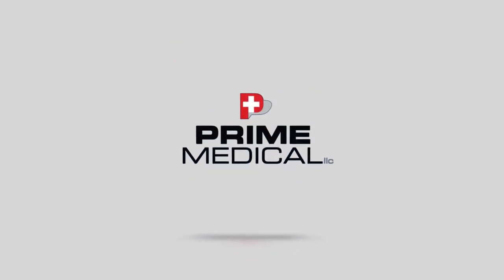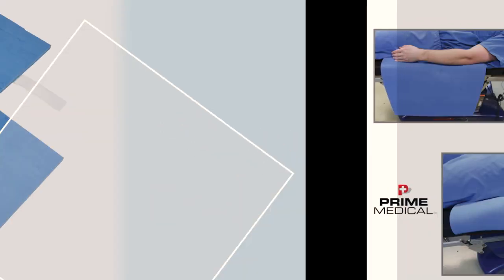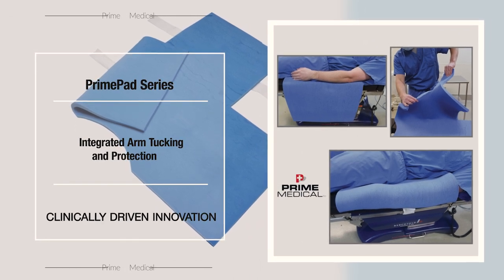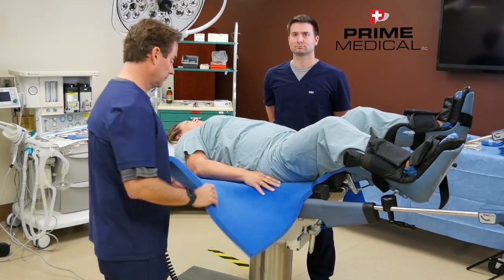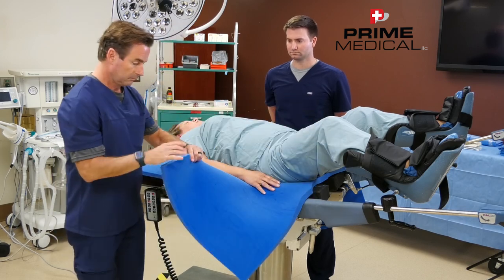Prime Medical. Prime pads are available with integrated arm tucking and protection in our Wing and Wing 2 pad formats. The Prime pad wing material can be customized to the patient by simply holding the material up to the patient's anatomy and tearing off any excess material in a linear plane.